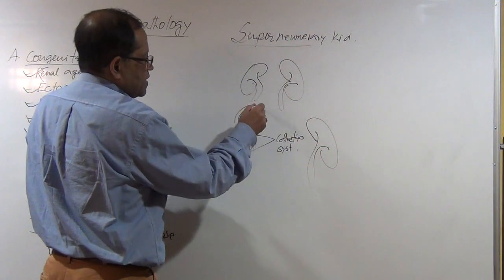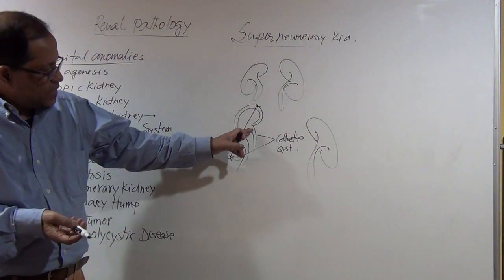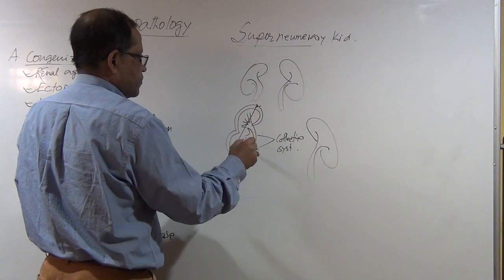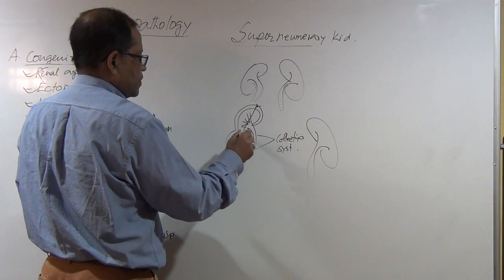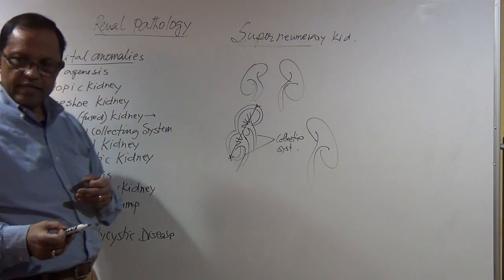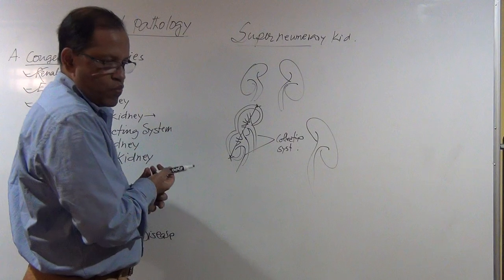So then, the size of the kidney will be longer. And it has a duplicating collecting system. So it would have a cortex in between too, right? It would be a cortex in between, like a band. Yeah. And you will see that its length is high, and when you click the color, you will see the two hilum.